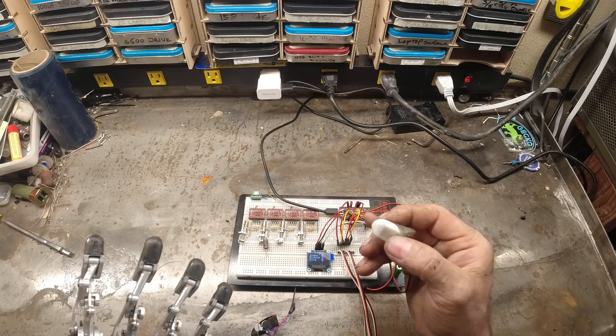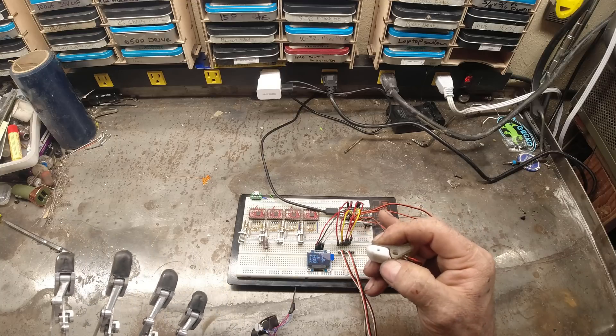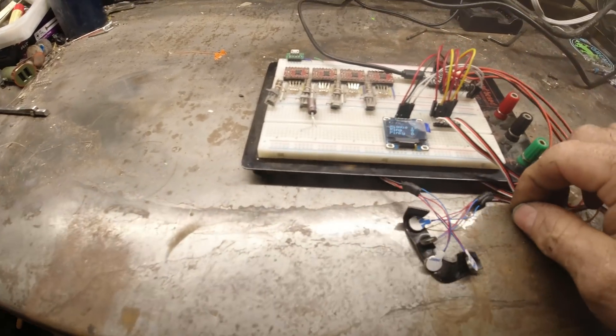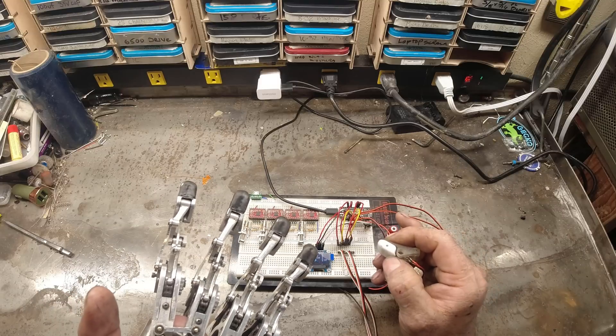The way that it should work is when I touch something with the new sensor fingertips, it'll cause the haptic motors in my socket to vibrate, letting me know that I've contacted the item.